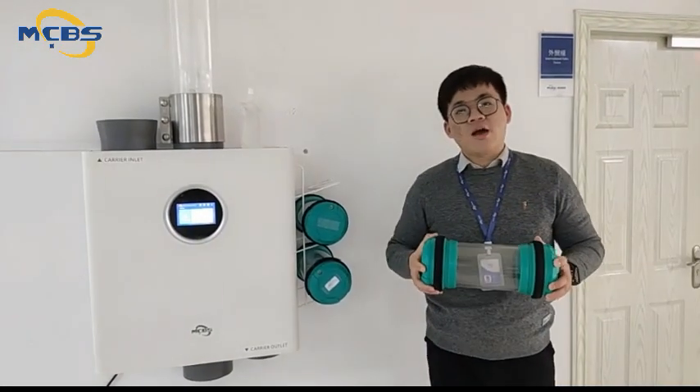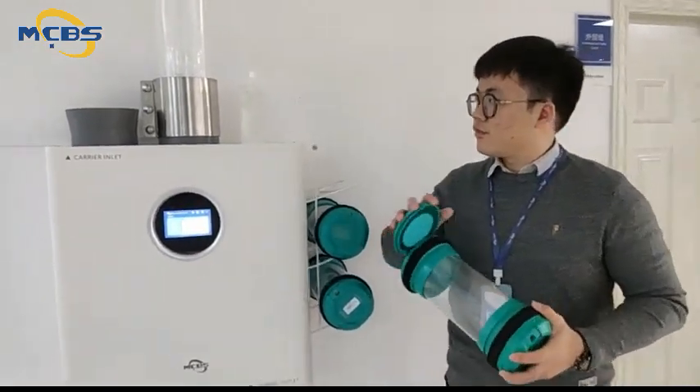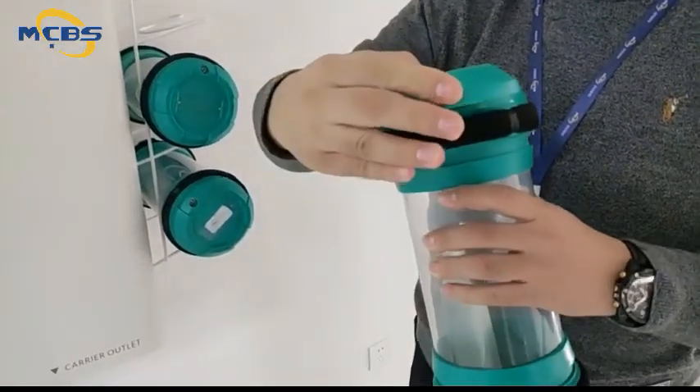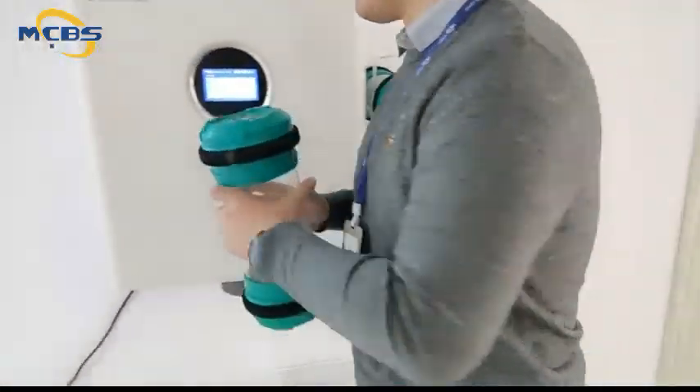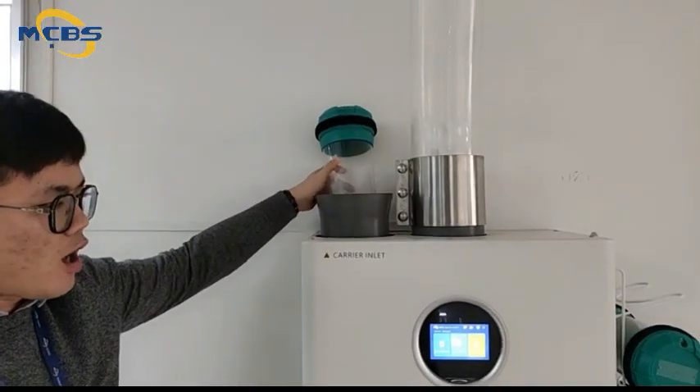So now we are going to initiate our carrier transaction. We are going to load the carrier to its loading bay of the station.